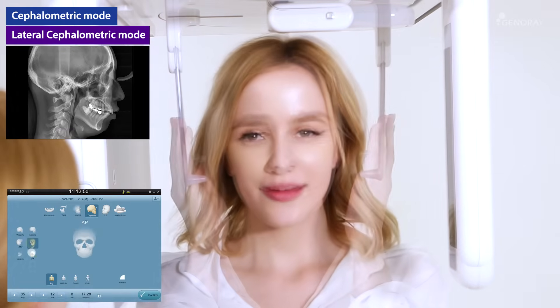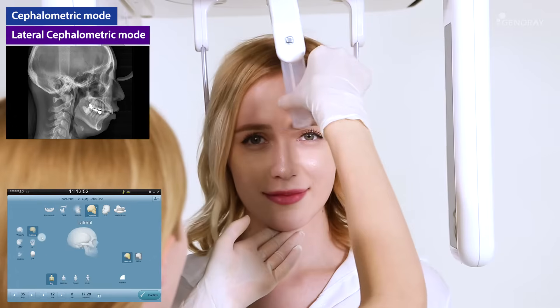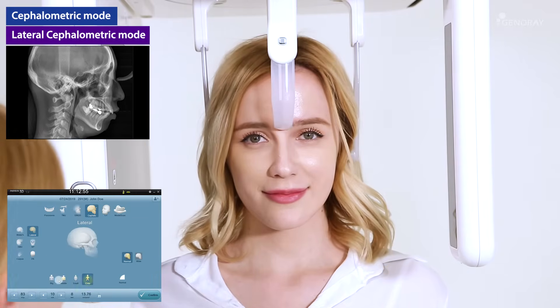Cephalometric exposure mode. After selecting the desired exposure mode, follow the instructions on the next page.